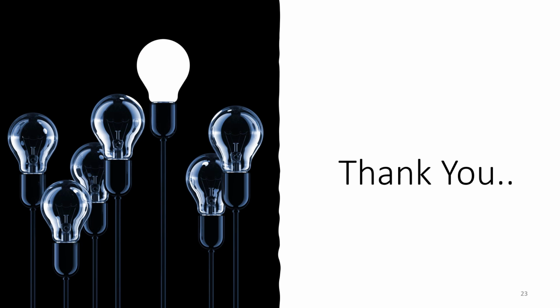That was about an illustration of how to interpret the culture and sensitivity result. What do you mean by MIC and breakpoint? It is not just the MICs, but the breakpoints carry value in interpreting the MIC as susceptible, resistant, or SDD. Then we have learned about ECOFF value when breakpoints are not available, and we have seen a case study on how to make use of the resistance genes for selection of antibiotics. We will see in detail in the next session, through other interesting case studies, how to make use of sensitivity results for antibiotic selection and dosing.